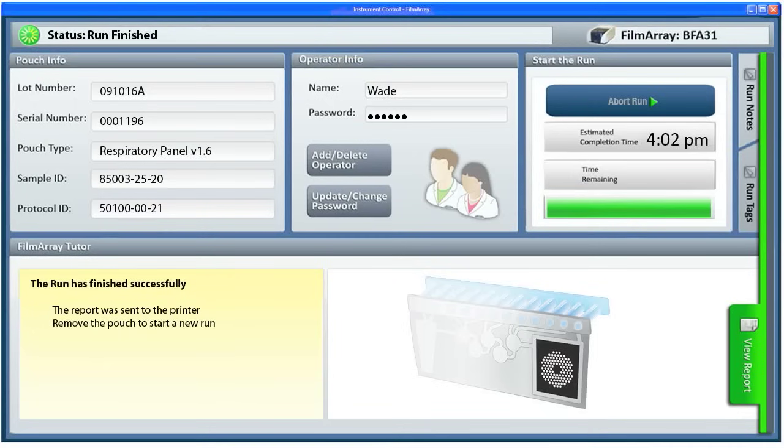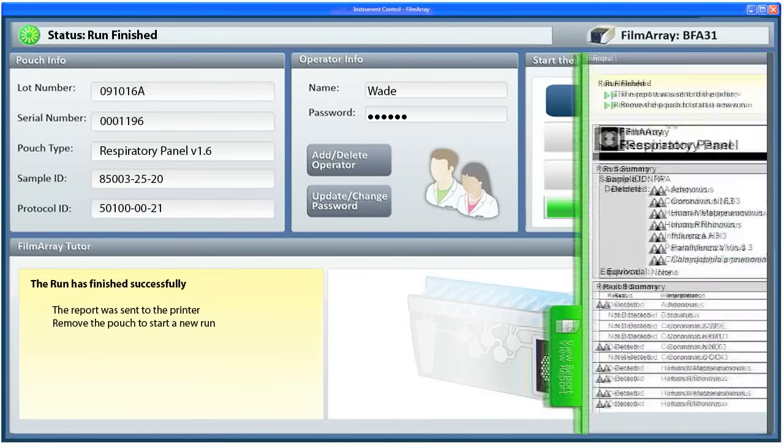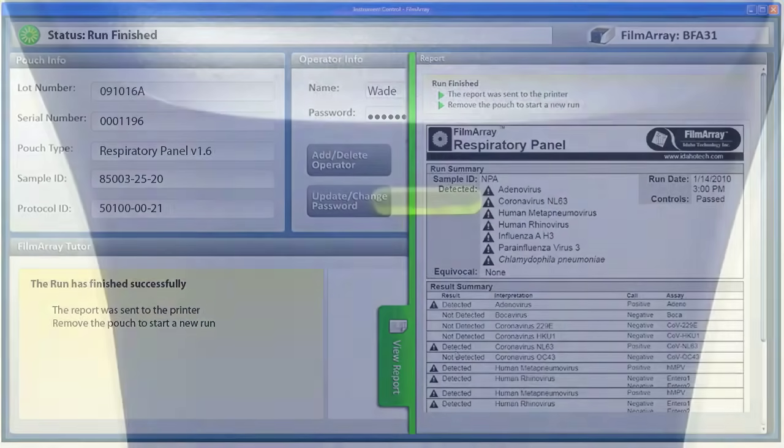The FilmArray software processes the data and makes a positive or negative call for each organism. These results are provided in one easy-to-read report.